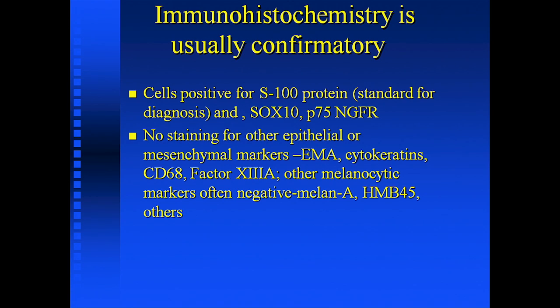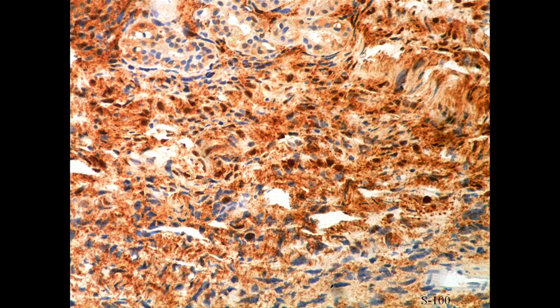All the other markers are negative and the melanocyte markers are negative in the spindle cell areas. Here's the S100 stain — you can see cytoplasmic and nuclear staining.